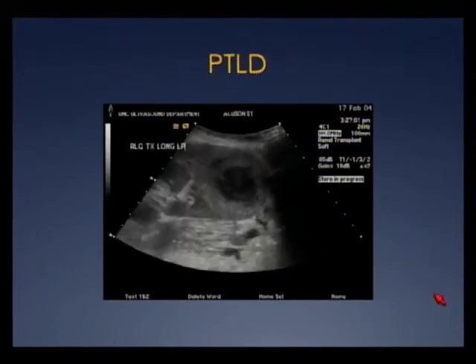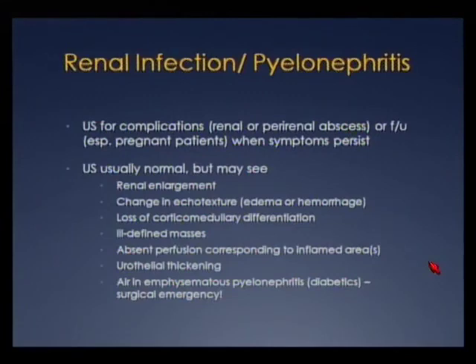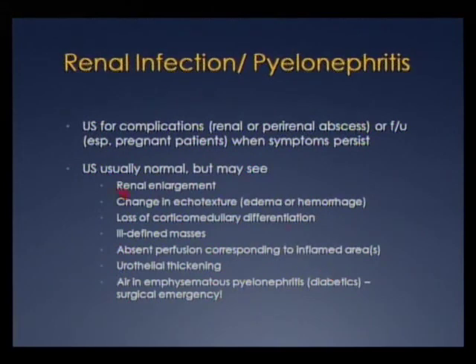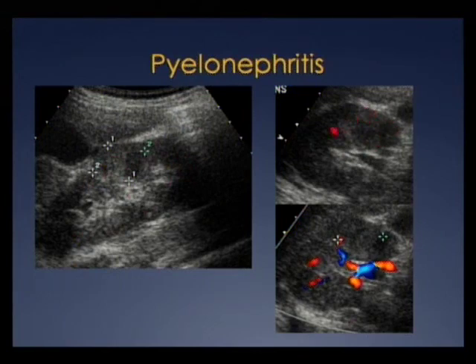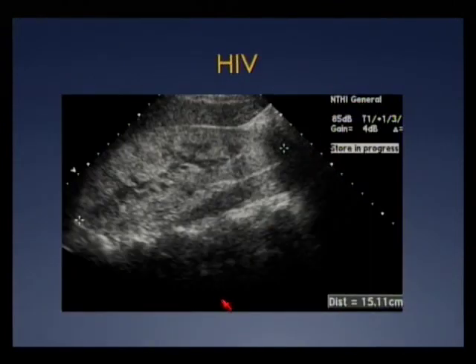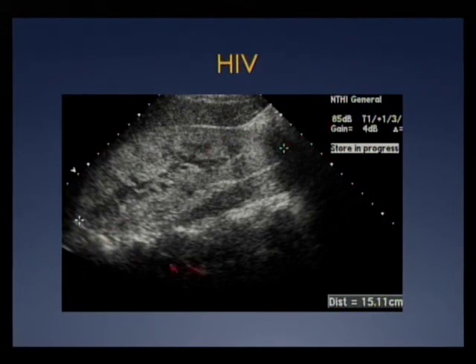Renal infection and pyelonephritis — we typically don't image the kidney with ultrasound for pyelo, but in patients who can't get CT, especially pregnant patients, we use ultrasound to look for complications. Ultrasound is typically normal in pyelo; findings may be very subtle. The most important thing to look for is air — emphysematous pyelonephritis is a surgical emergency. Here's a patient with pyelonephritis where findings are extremely subtle — questionable cortical echogenicity change and possibly decreased flow. HIV nephropathy hallmark: enlarged echogenic kidneys bilaterally — here's a 15-centimeter echogenic kidney.